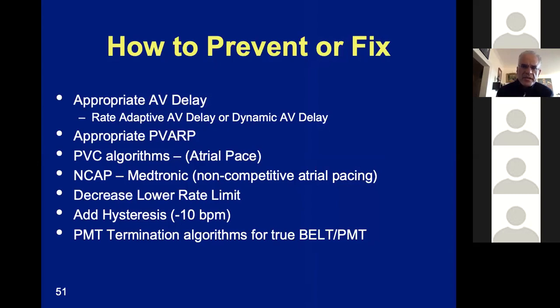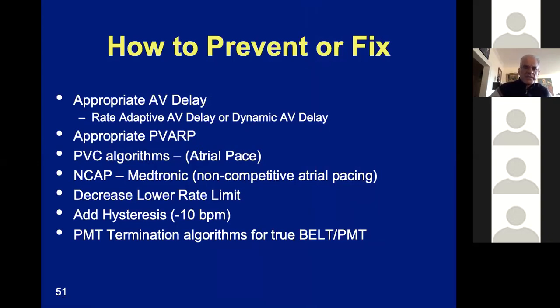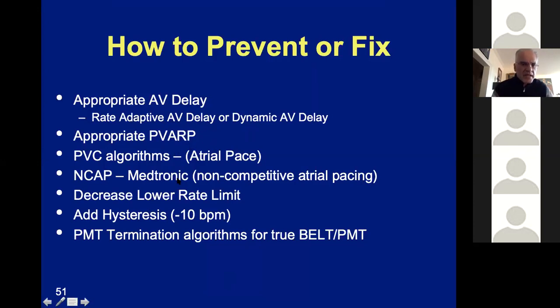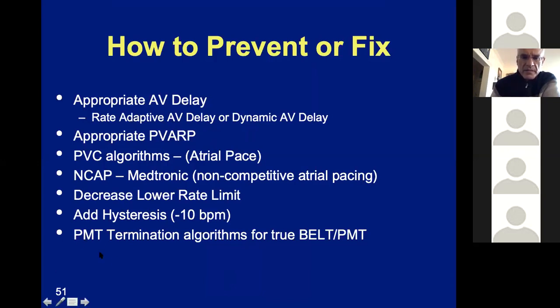Here is a summary of how to prevent or fix competitive atrial pacing. PVC algorithms can be used. The key is to try to avoid faster pacing rates and to adapt timing intervals to faster rates. Turn on rate-adaptive AV delay if available. Turn on rate-adaptive PVARP and use those other algorithms. There are no specific algorithms for RNRVS termination, but there are algorithms for PMT termination — so PMT is probably easier to deal with than RNRVS.